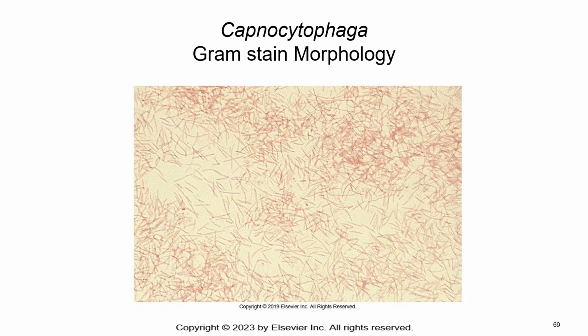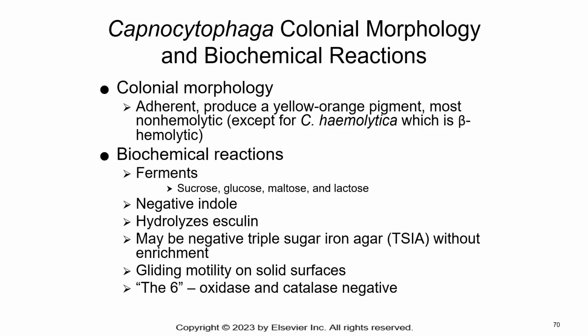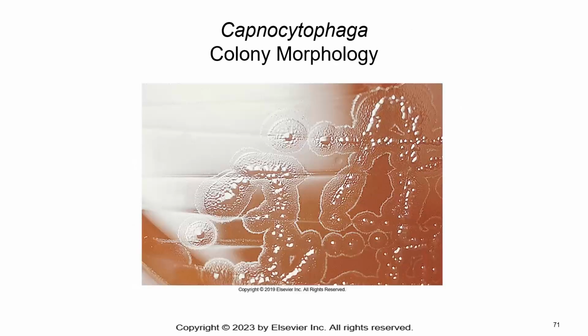So here you can see what they look like under the microscope. Very long. Some of their biochemical reactions are listed here. And here you can see it on a plate.